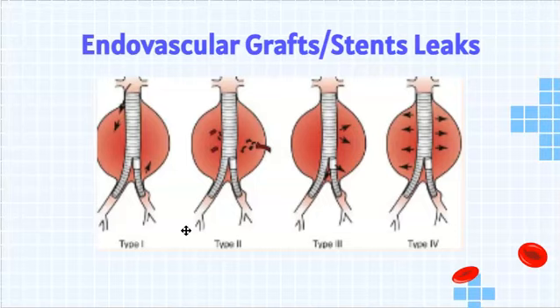There are a few types of endografts. There's a few types of leaks that can occur with endografts. It's a complication that can occur, and they're monitored post-placement. They usually occur from a failure of the device at placement, changes over time, or a failure to control blood flow within the aneurysm. So there's 4 different types. We'll just briefly go over each type.